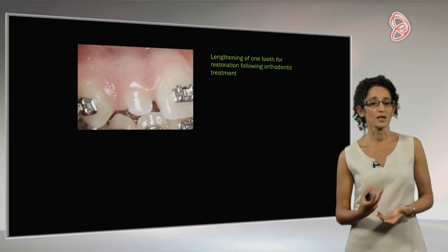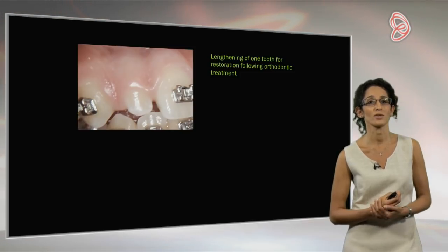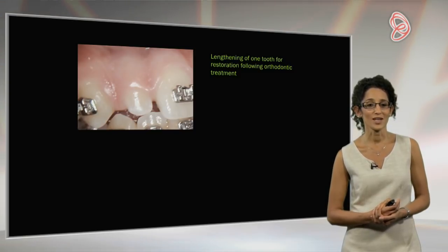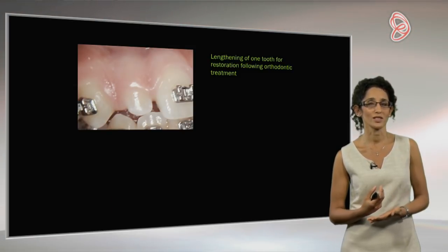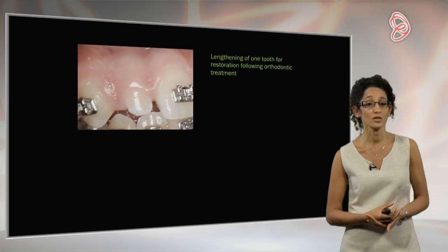This is another case. I'll often end up having teenagers and children referred to me now because our dentists have realised that actually lasers are a little bit more patient-friendly than packing them off to the oral surgeons, and certainly not as scary. So this girl, she was in her early teens, petrified of needles, petrified of dentistry, full stop. But she had this peg-shaped lateral incisor tooth that needed some contouring, it needed reshaping.